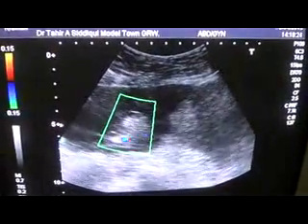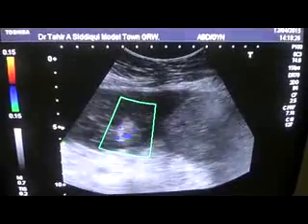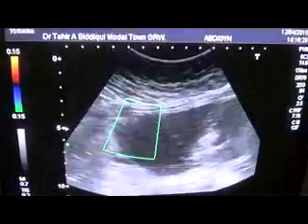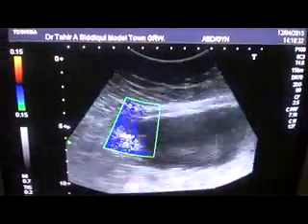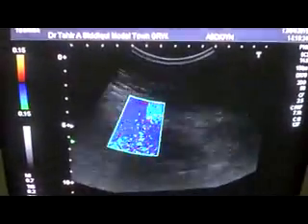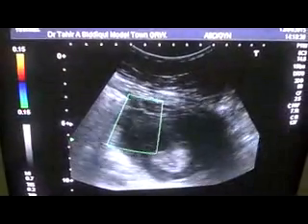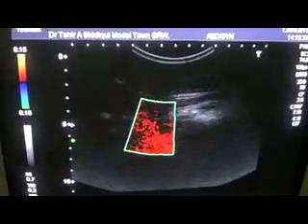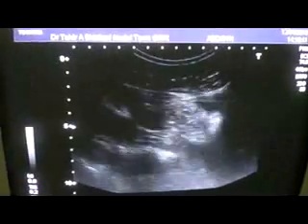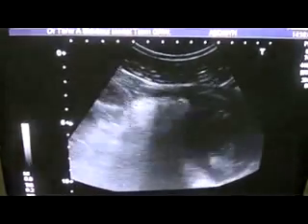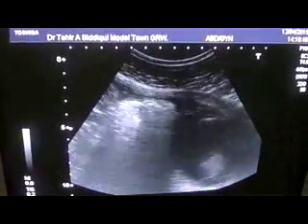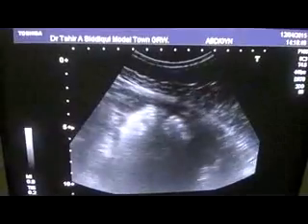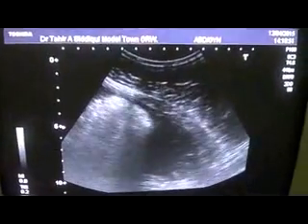This is a ruptured ectopic pregnancy with fluid all over the abdominal cavity. This fluid traverses into the right paracolic as well as the left paracolic gutter, with bowel loops seen floating in it. This is the right paracolic gutter and you can see the fluid clearly.